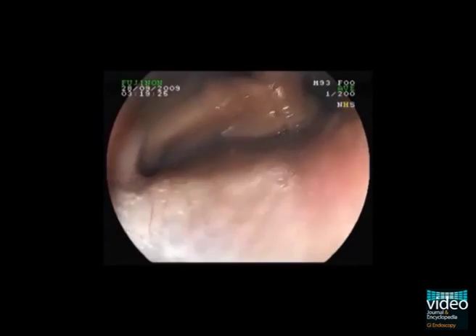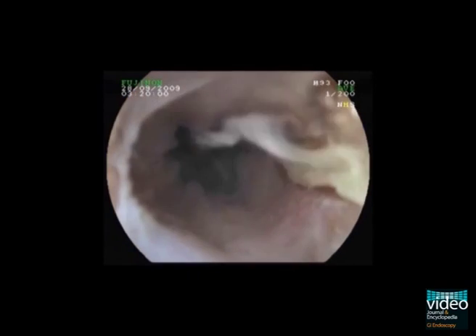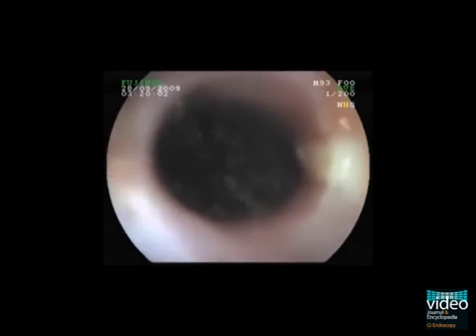This patient is submitted to our endoscopy unit because of recurrent cough and severe dysphagia. Subsequent to the esophageal intubation, a fibrinous lesion is visible at the 3 o'clock position.